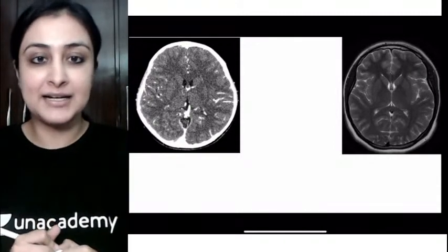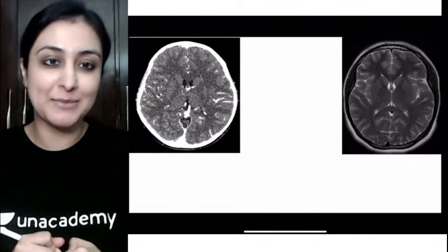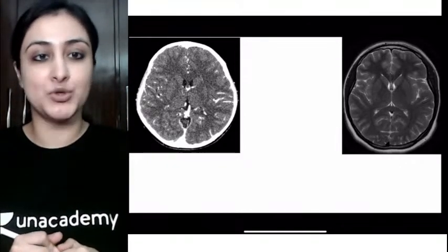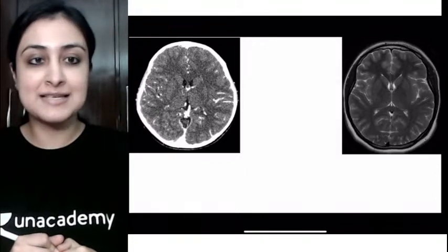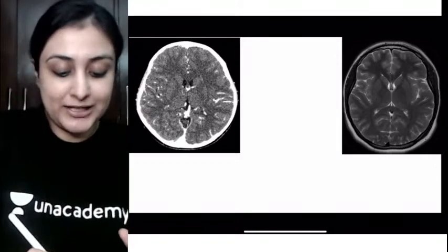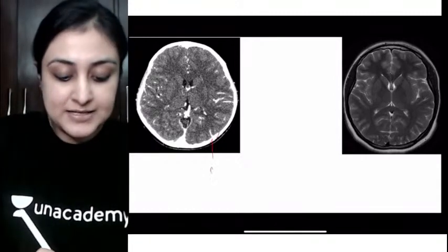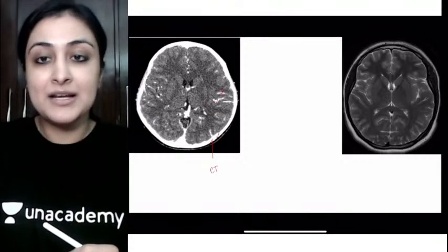All right, so let's start. Before we go to MRI sequence identification, we need to identify MRI, right? So how do we start? We start by looking at the bone. So always look at the cortex. Remember our thumb rule: C for cortex, C for CT. Anytime the cortex appears white, as you can see, this outermost part, which is the bony cortex, if it appears white, it is a CT scan, right? It's a contrast enhanced CT. You can also see the vessels which are enhancing.